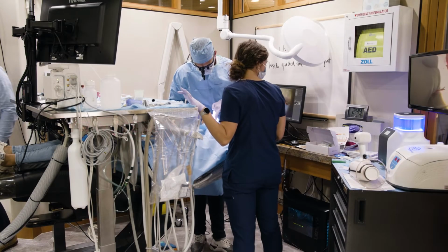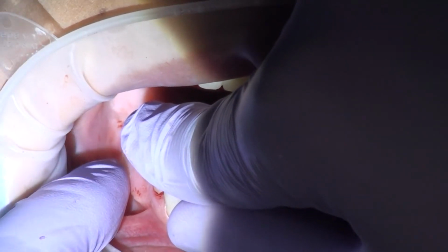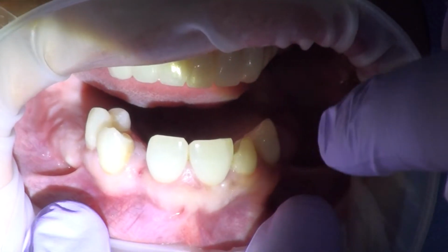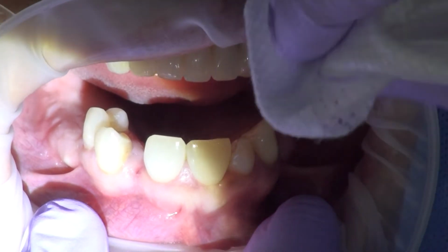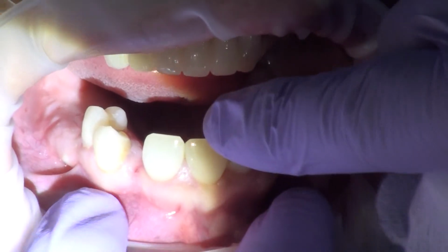Okay, here's our patient for number 13 and 14. Again, 13 is a native bone, decent bone quality, a little bit of a low density area, and then number 14 is only about 6 millimeters into the sinus. So we're going to go ahead and do surgery right here. I went ahead and put just about a carp in the buccal and maybe a quarter a carp at the palate. I used Septocaine 4%, 1 to 200,000 epinephrine, and just waiting for it to soak in a little bit.